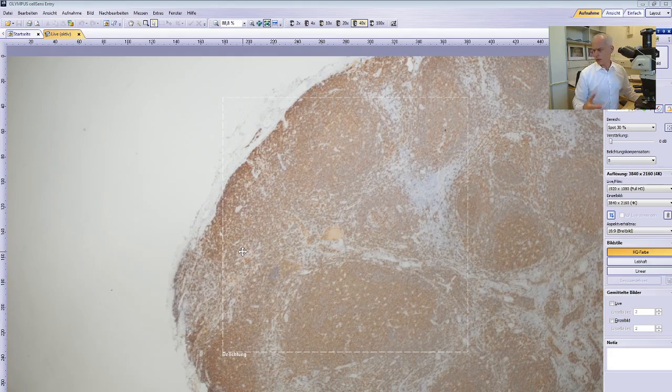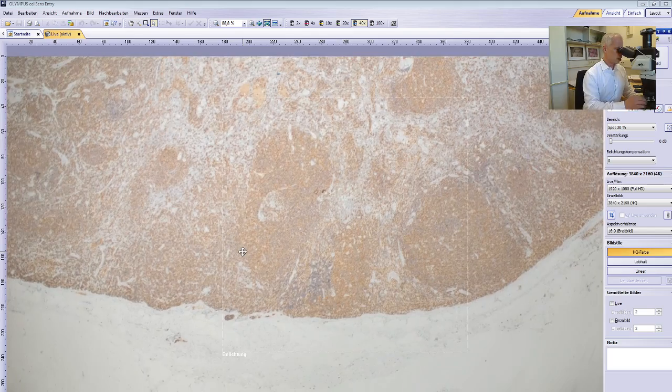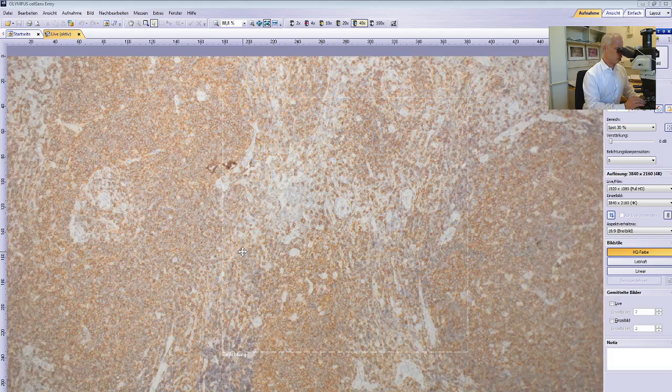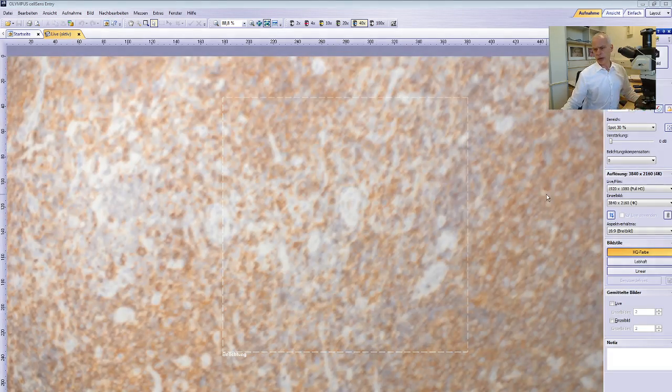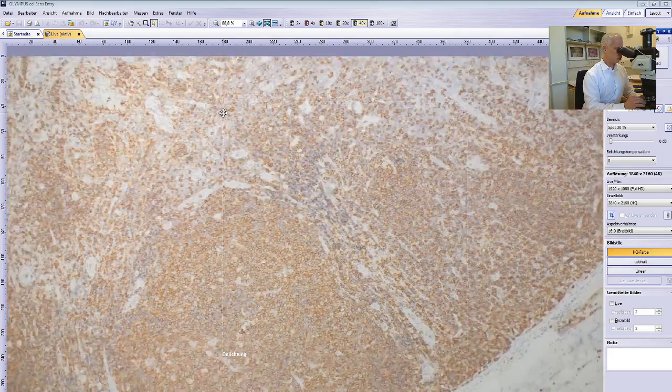You see also a little bit that the B-cell areas are a little bit expanded. You see some activation of B cells also in the interfollicular region. Sorry, on the right we are here. And this is the germinal center. And you see that in the interfollicular region there are also larger activated B cells. So that's something we find in a lot of inflammatory conditions.